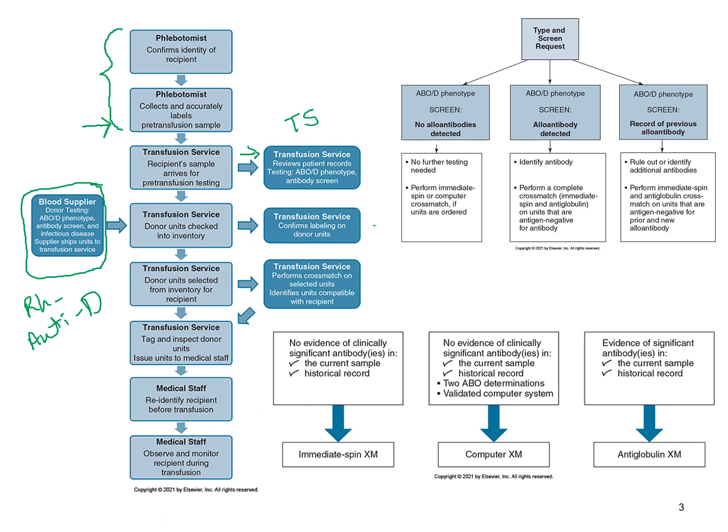And so that's just doing the blood type and the antibody screen. Now that testing, we're going to break this down as far as making the decision of, once you've done all of these first few steps, once you decide, okay, I'm going to select the units, there are a few things that you've got to be sure of first.